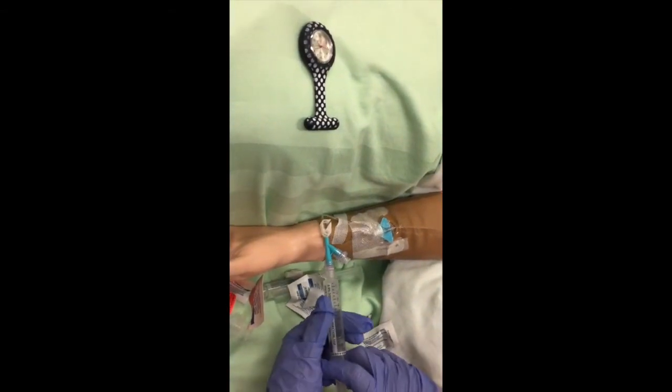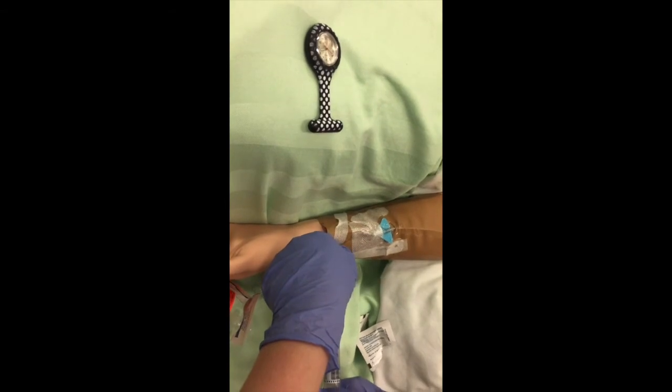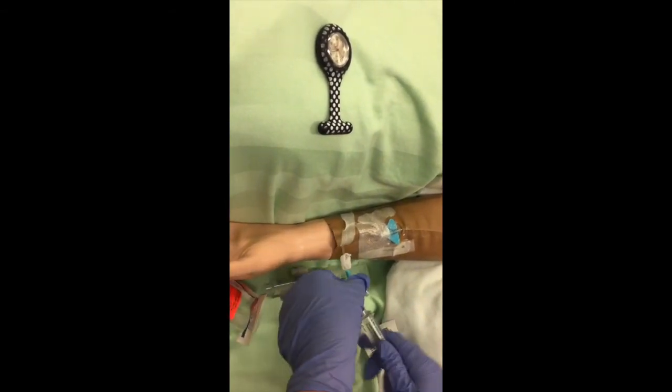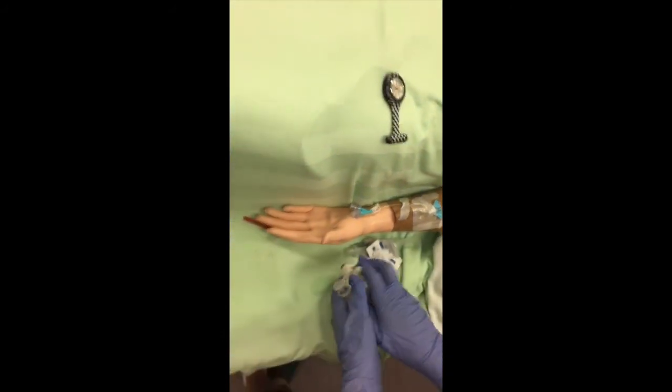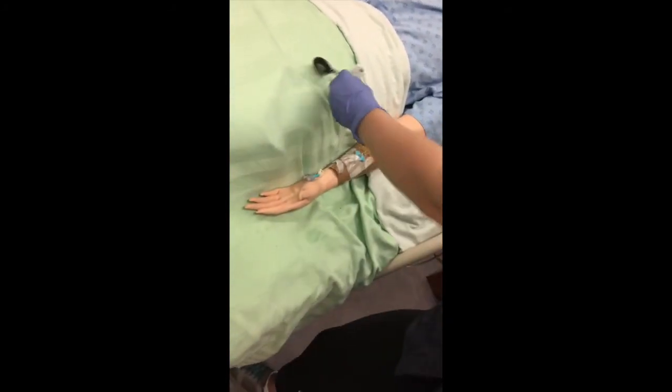All right, so now I'm just going to clamp it under positive pressure. So we're going to do a little bit, and then half a mil, and then clamp. Okay, that's all good. Take that, clean up my area a little bit.